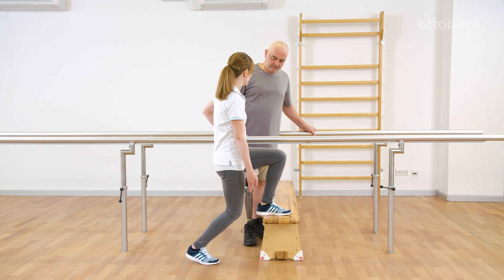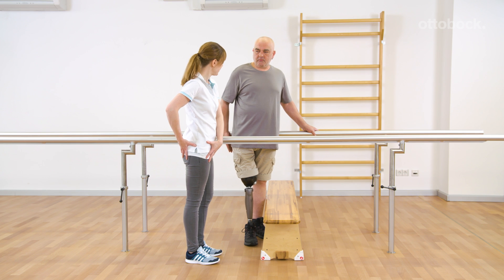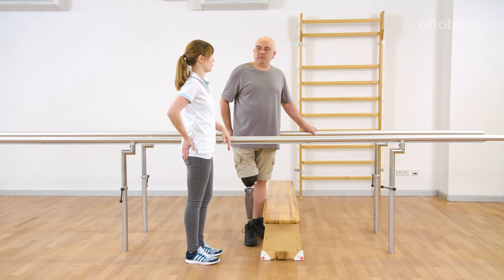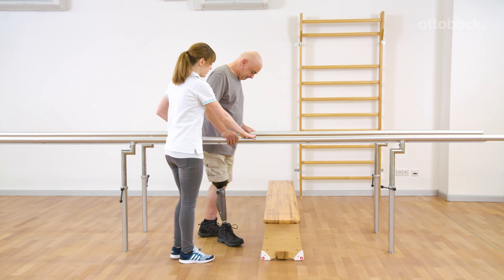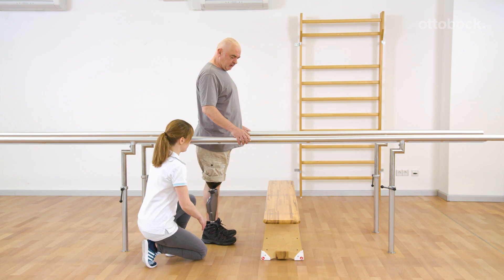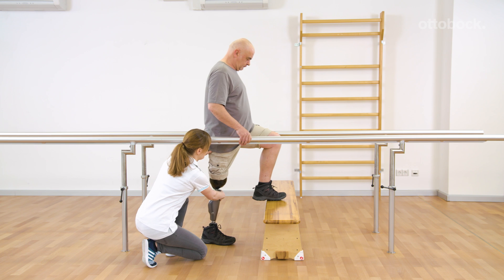Due to the knee extension moment caused by the ground reaction force, Gerhard feels secure as he doesn't feel that the stance release has already been triggered. Only by a subsequent hip flexion movement would he initiate swing phase. The aim of the exercise is to keep the hip extensors activated and to stabilize the hip.